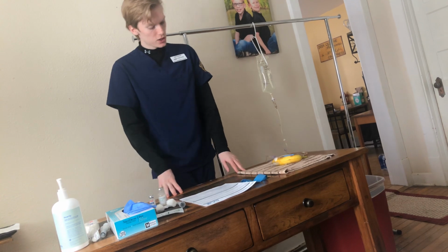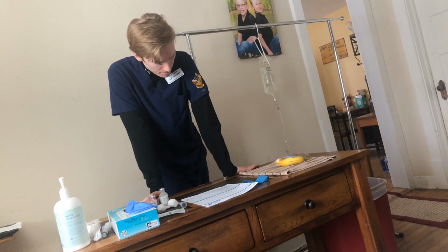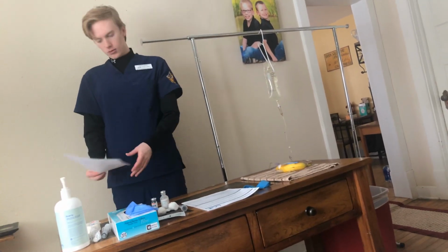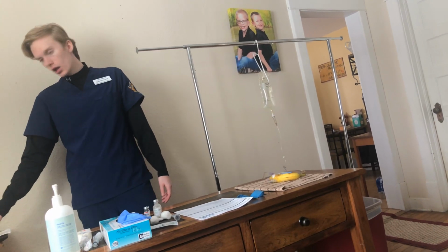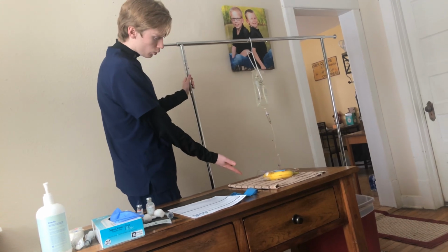I'm going to get 2 patient identifiers. Going to get your full name and date of birth. Wonderful. So again, I'm going to do my 3rd check and again make sure that we meet the 6 patient rights and we have everything in order. Now that we have done that, we are good to DC the fluid.